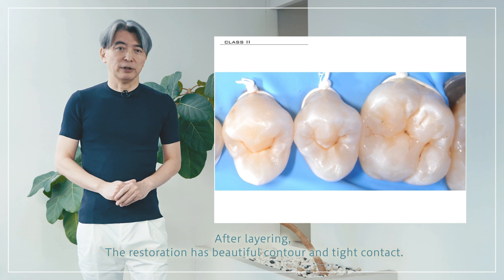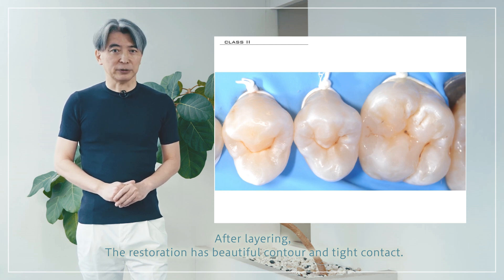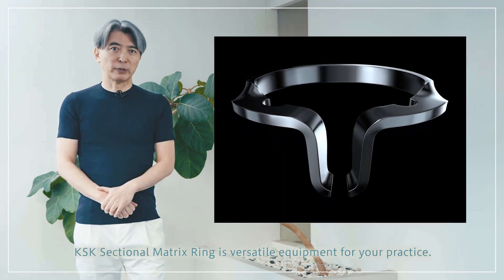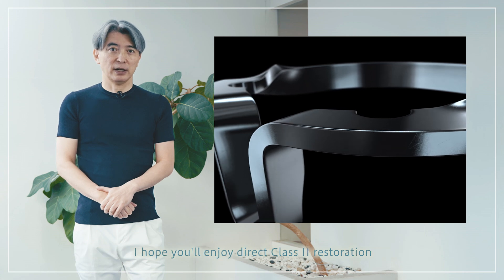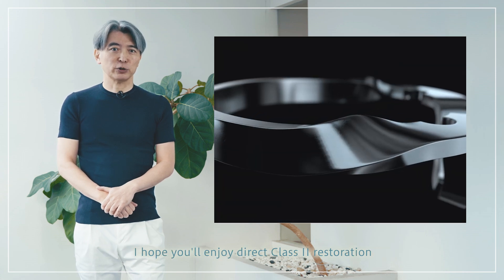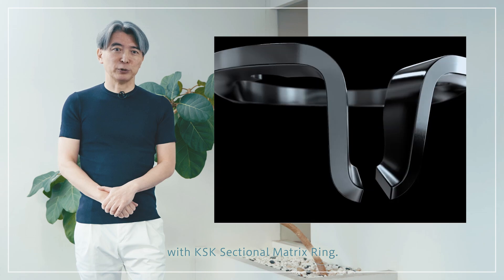After layering, the restoration has a beautiful contour and tight contact. KSK sectional matrix ring is versatile equipment for your practice. I hope you enjoy direct class 2 restoration with the KSK sectional matrix ring.